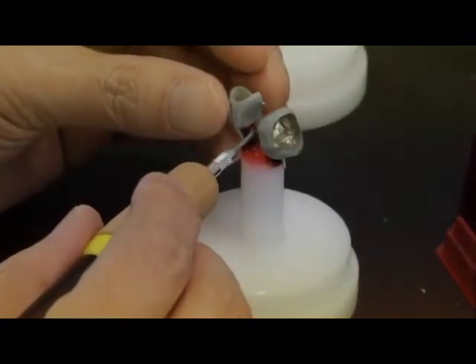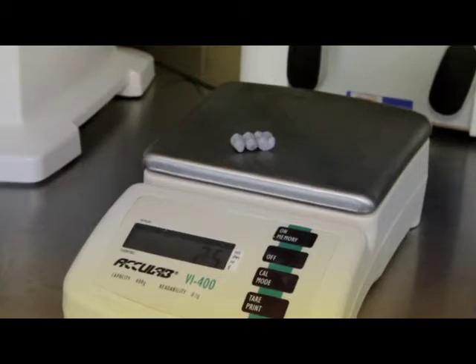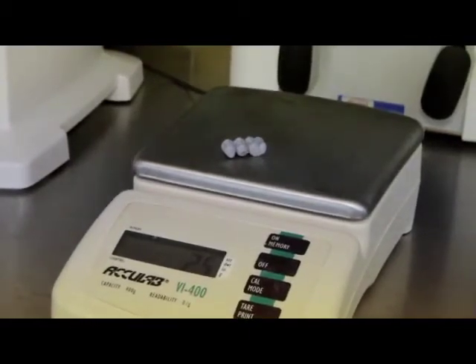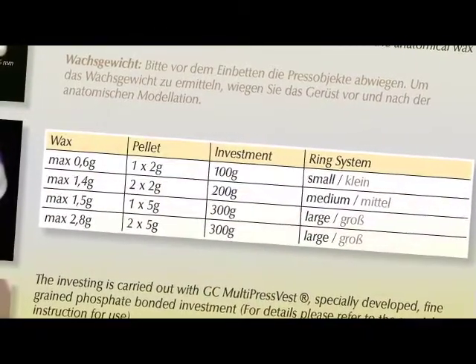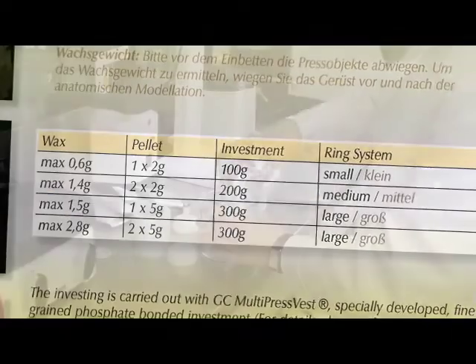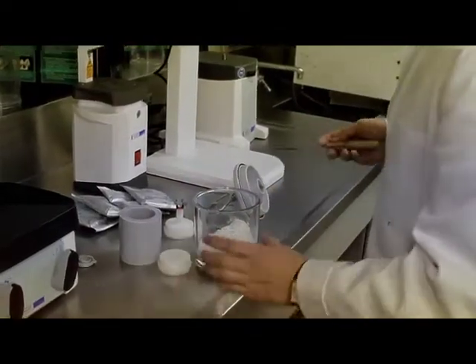The patterns are waxed carefully onto the ring base forming an angle of 45 degrees. It is important to weigh the objects before investing. To get the right wax weight, the frame structure has to be weighed before and after the anatomical wax-up. After sprueing, the ring can now be invested using GC Multipress Vest.